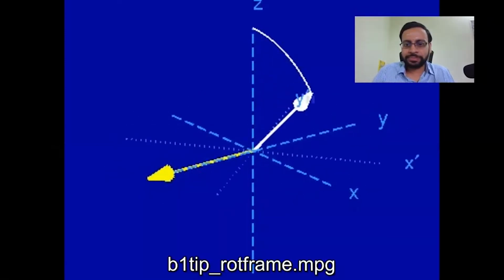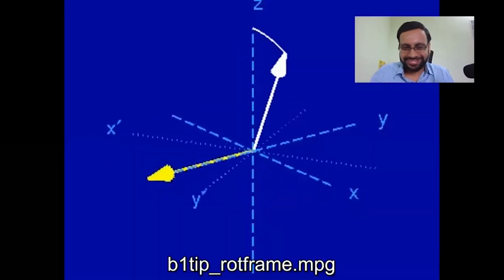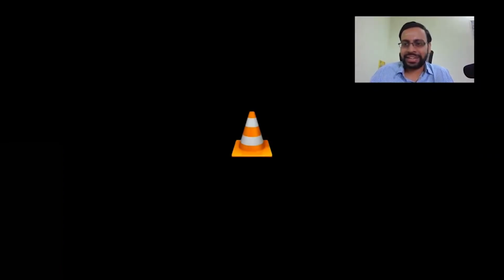Is that clear? Yes, sir. Good. So the angular velocity during precession remains the same. Right, correct. That's right.